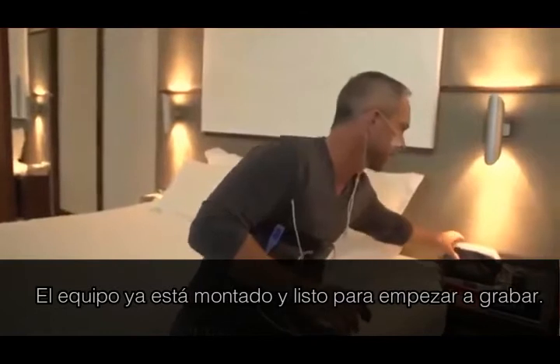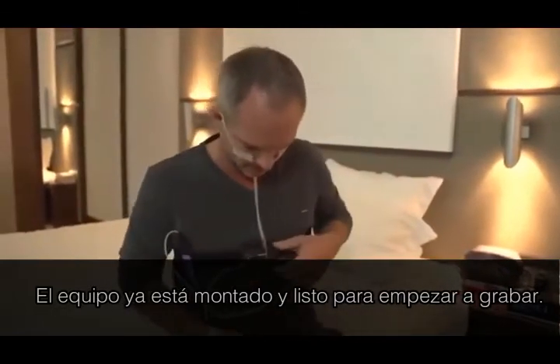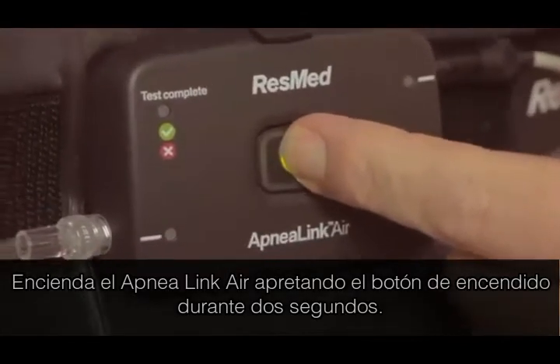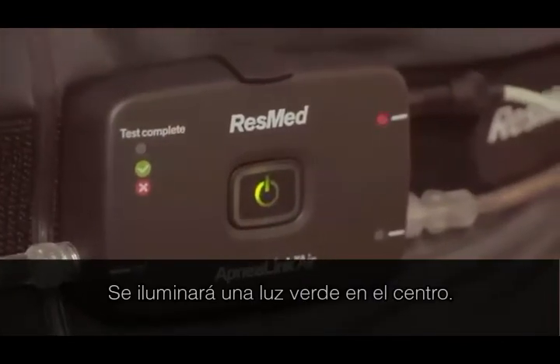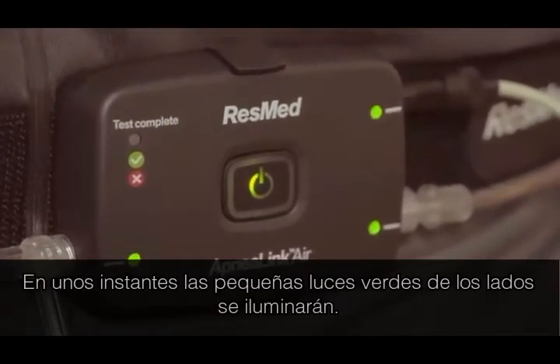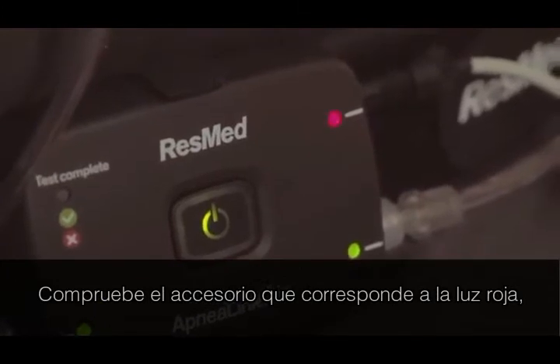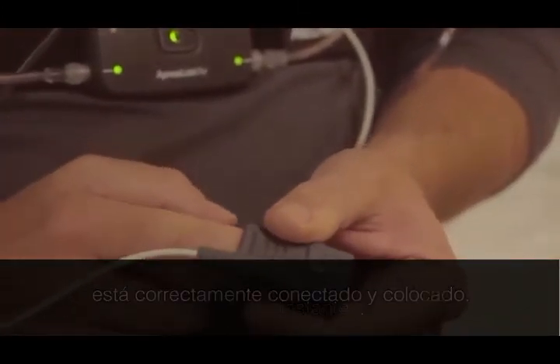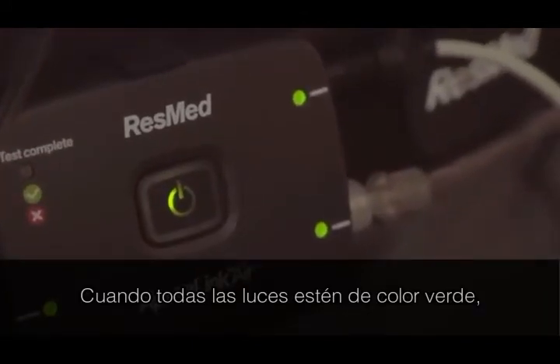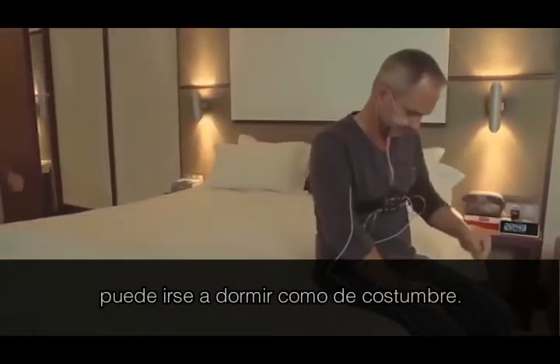The system is now fully assembled and ready to start recording. Start the ApneaLink Air by pressing the on-off button for two seconds. The central green light will illuminate and will dim automatically after 10 minutes. After a few seconds, the small lights on the sides will illuminate. If any light blinks red, check that the accessory corresponding to the light is properly placed and connected. Once corrected, it will switch to green after a few seconds. When all lights are green, you can go to sleep as you would normally do.